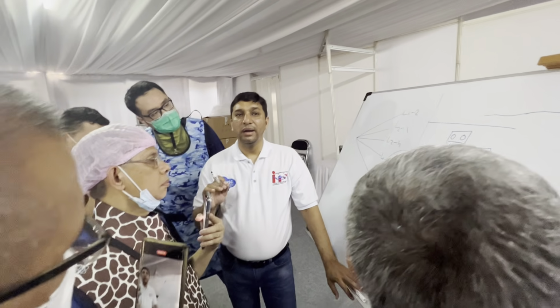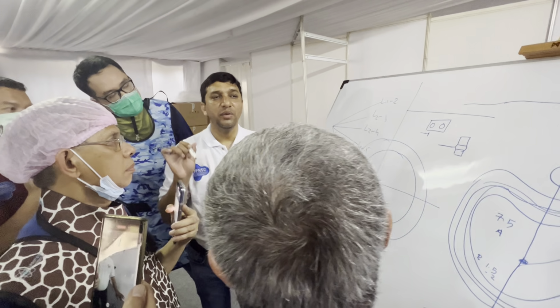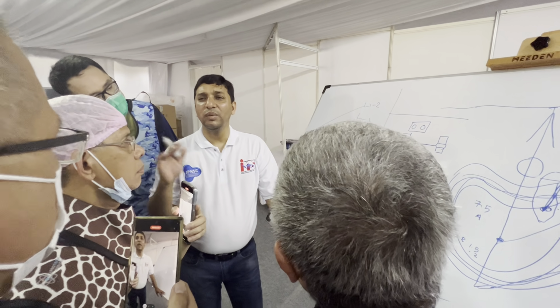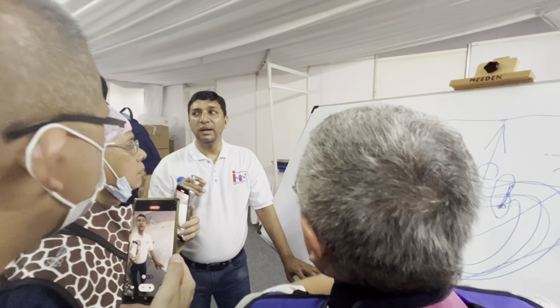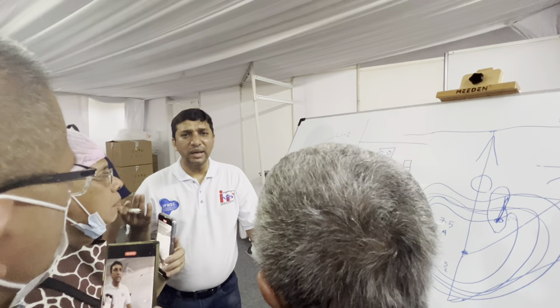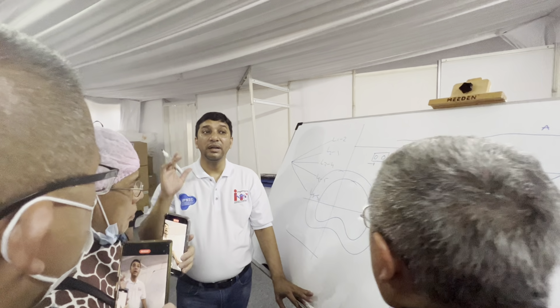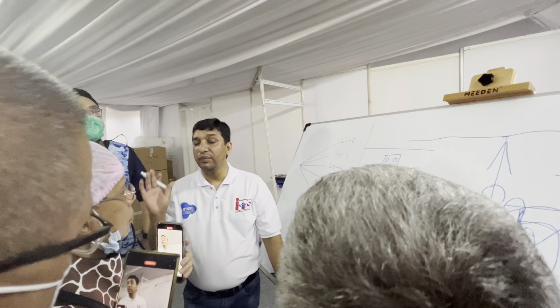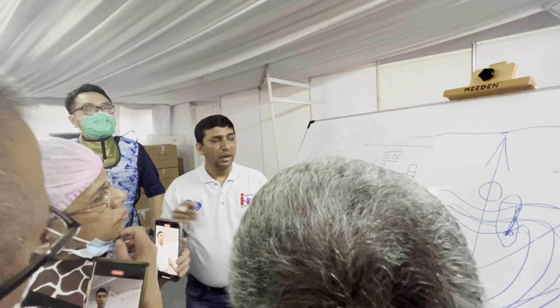But again, I tell you, a very simple thing: if your patient is awake and you touch the nerve, the patient will tell you. So you don't have to worry about anomalies. You keep your patient awake. At any doubt, tell them, move your leg, my friend. If they are moving the leg, no problem. That is your safety. The awake patient is your best neurological monitor. If you have an awake patient, you don't worry about anything.